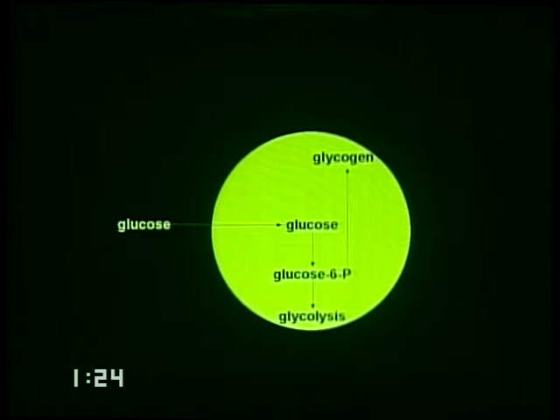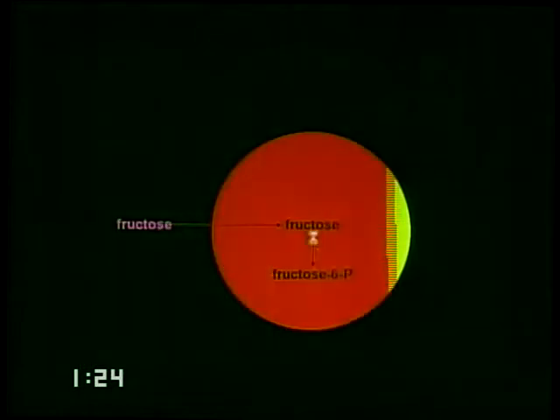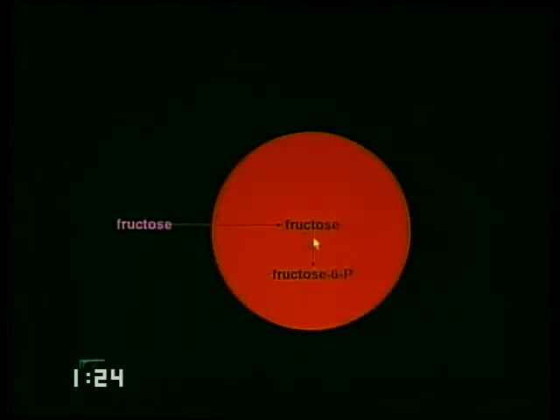what's going on. If you take a typical cell and you feed it with glucose, the glucose is phosphorylated immediately and then it is broken down. So it does not stay in there forever. If you, however, give a cell fructose or a glucose analog, it gets phosphorylated, but it cannot be broken down. It just stays there and can be detected if you can detect the glucose analog.